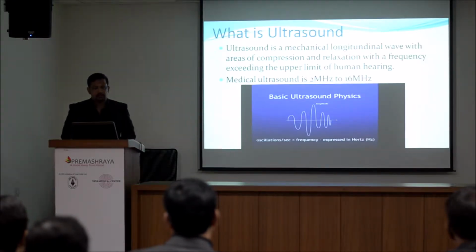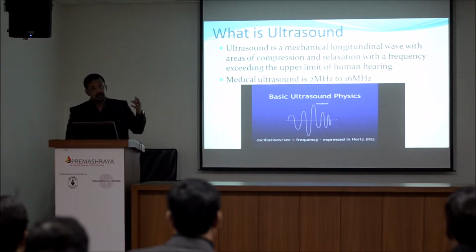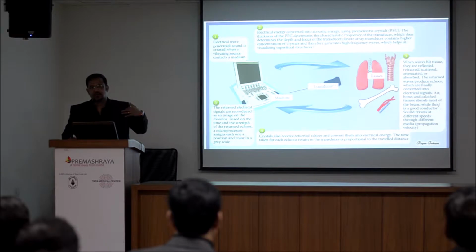What is ultrasound? It's nothing but a mechanical longitudinal wave with an area of compression and relaxation, which cannot be heard by a human ear. And the frequency is between 2 megahertz to 16 megahertz. This is the way ultrasound is produced, which you see on your monitor.